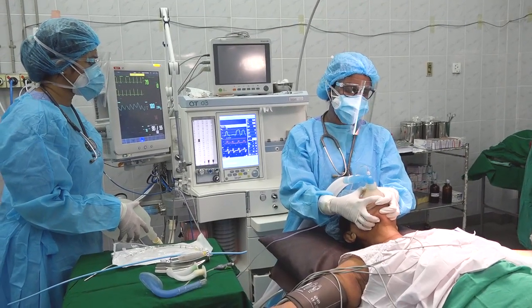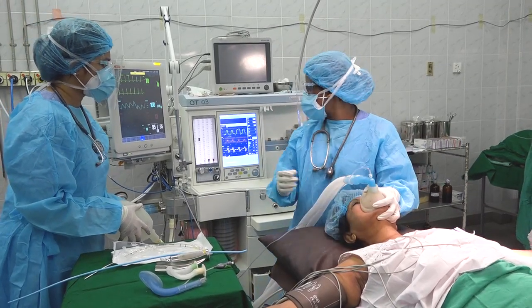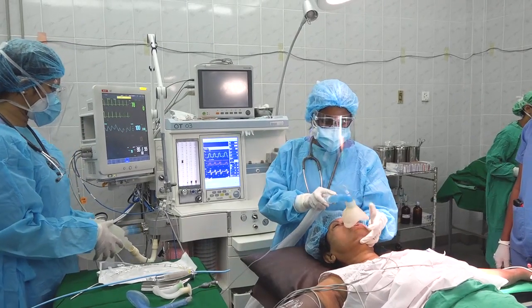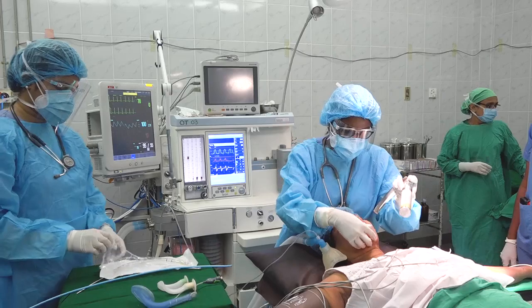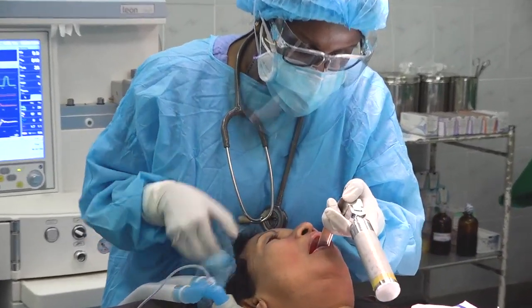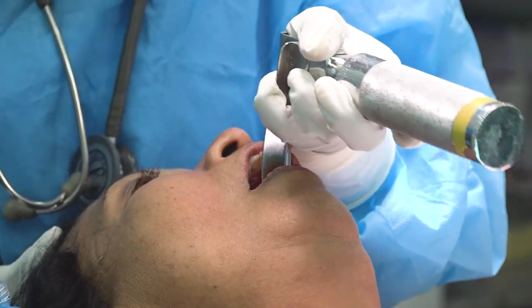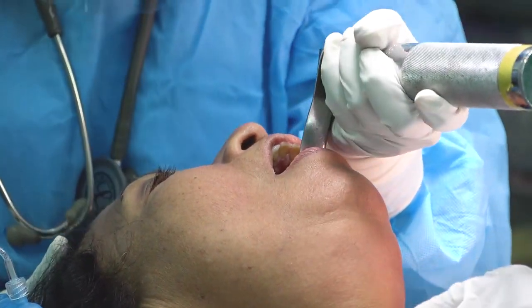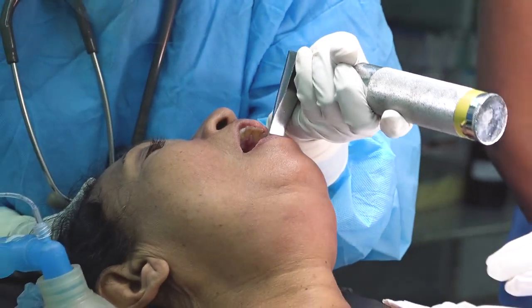You should start attempting at intubation only when the patient is deeply anesthetized and very well relaxed. So to check whether atracurium or the other muscle relaxant that you have given is working, either you have to check neuromuscular monitoring or wait for a standard time. For instance, if you have used atracurium as the non-depolarizing muscle relaxant agent, you have to wait about 180 seconds for it to act optimally.